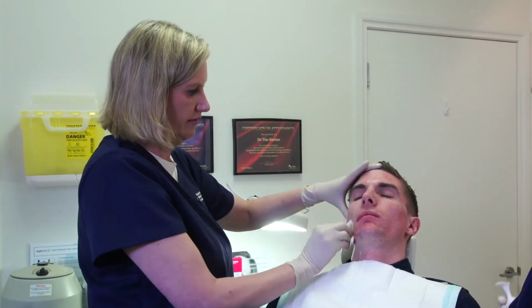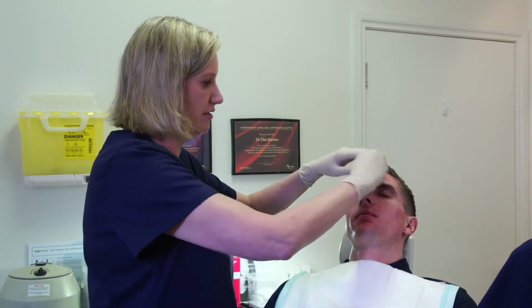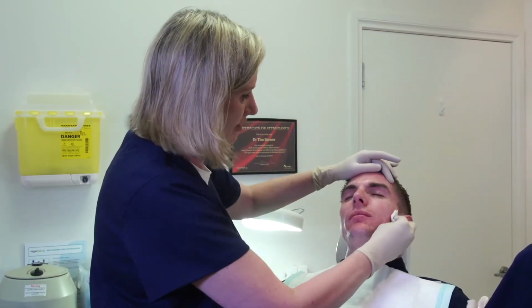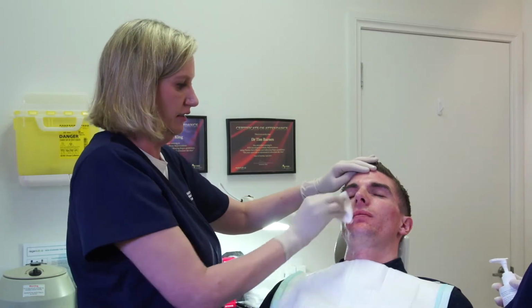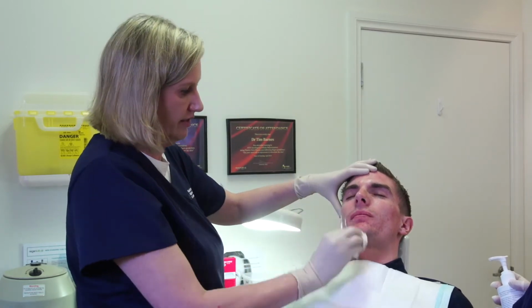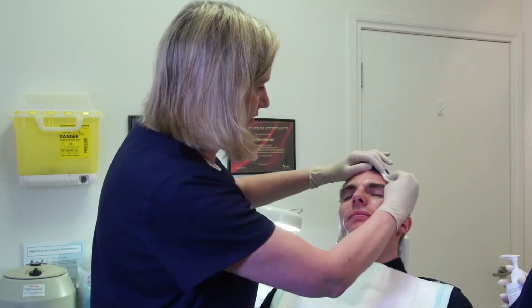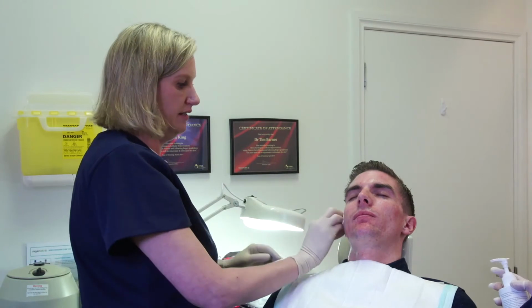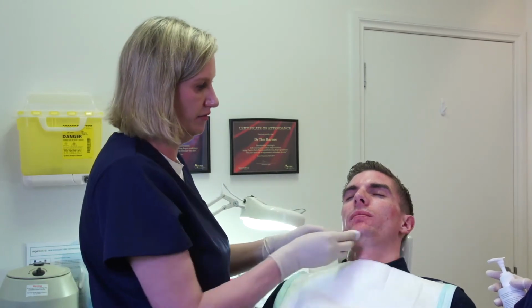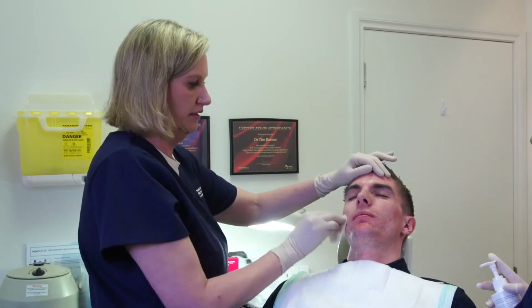This is also going to minimise his pore size, hopefully smooth out some of those lumpy, bumpy little bits of residual acne he's still got. And we'll address any areas where we've got scarring with a slightly deeper depth of Dermapen penetration. So he's had his local anaesthetic cream on for a period of about half an hour or so, I think.